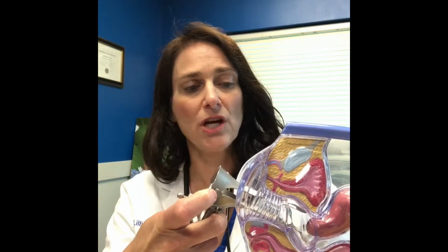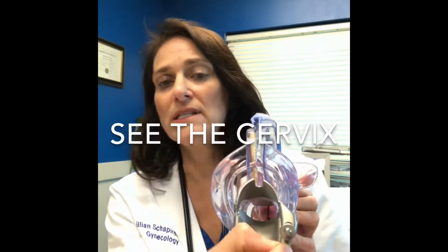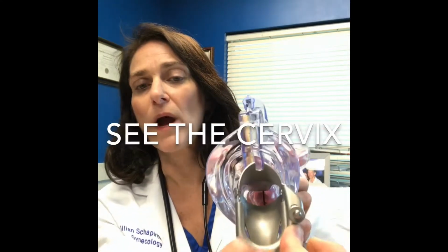So the speculum goes inside of the vagina, just like in a regular pap smear, and you can see in there that we are looking right at the cervix. We put vinegar on your cervix. Sounds kind of crazy, but the vinegar reacts with the carbohydrates in the cell and makes it possible for us to see which cells are absorbing more and are therefore somewhat abnormal.